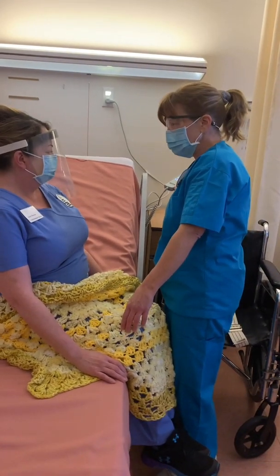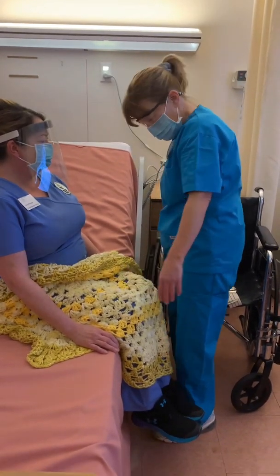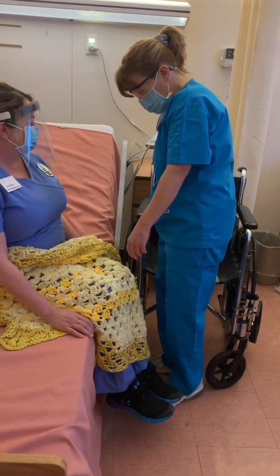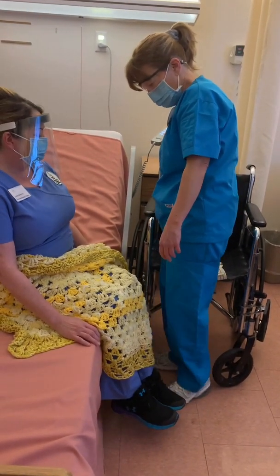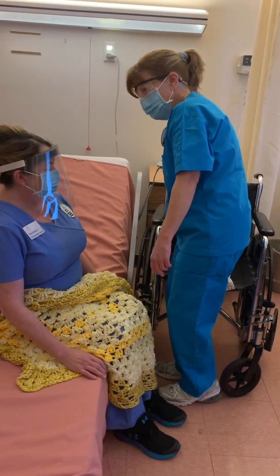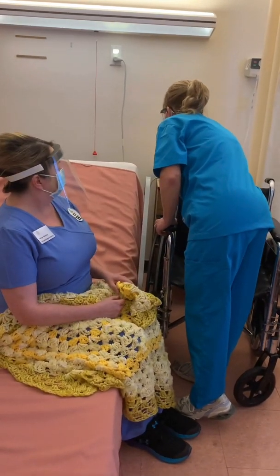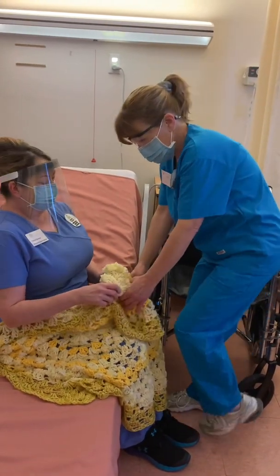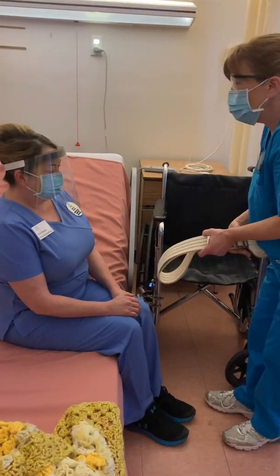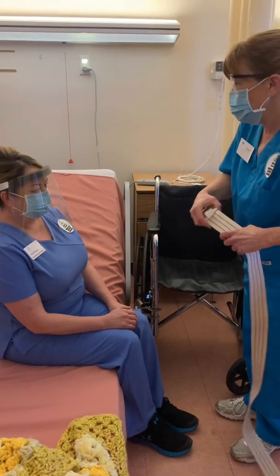I see you have your pretty blue sweater on today. Was that the one you chose this morning? Yes. Good. There. Is that comfortable? Your feet are okay? Yes. Okay. So I'm going to take this blanket just for a moment, if that's okay with you. And I'm going to use this transfer belt that's in your care plan to make sure that we can safely help you stand up, if that's okay.